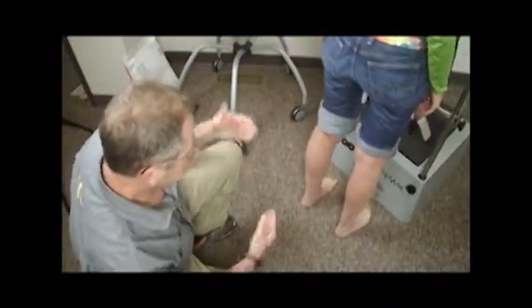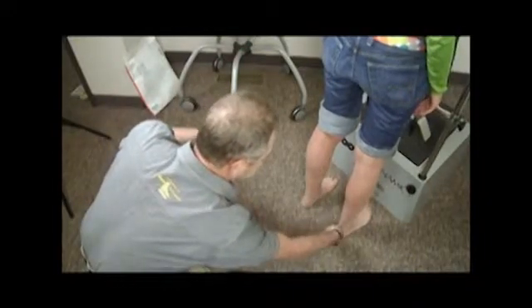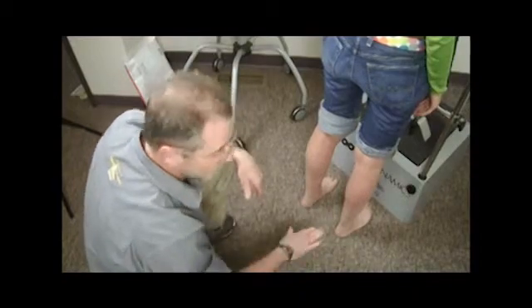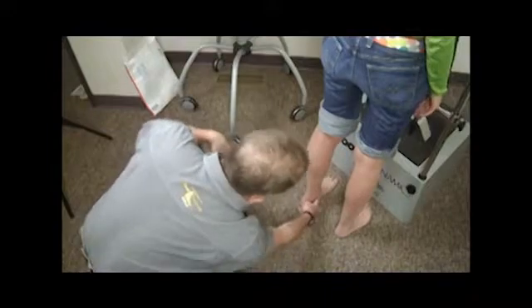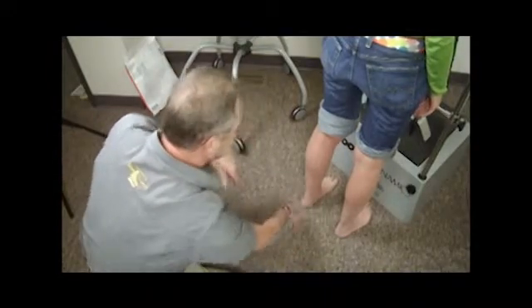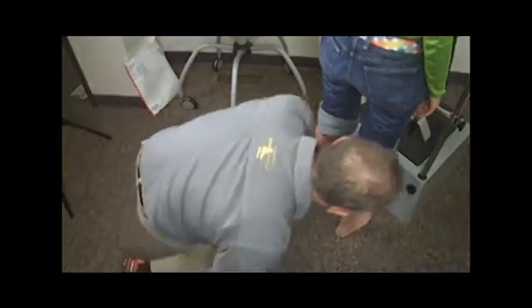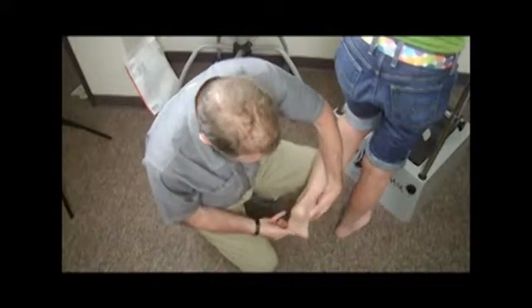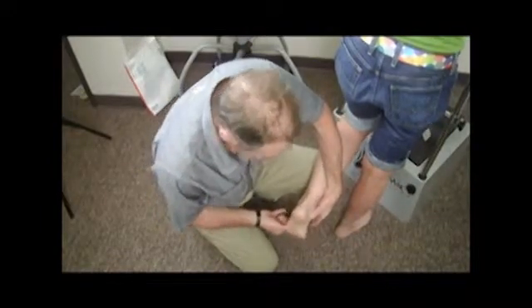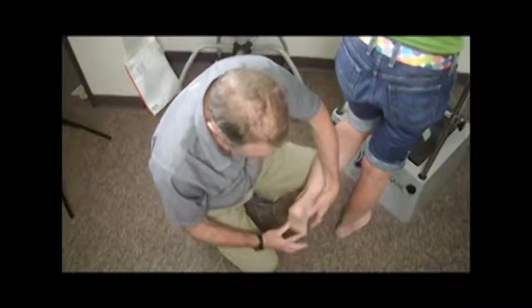Now from the hind view, we're going to look at the heel to see if everted or inverted, whether the foot is excessively pronated or supinated, the arch height, again, any accessory navicular or any other anomalies showing. Now we're going to sight the forefoot, so I'll take your foot and lift up. And the way I do it is I grab the subtalar joint with my thumb and index finger, or second finger, manipulate the foot to neutral, slightly load the lateral column, and then sight the forefoot.